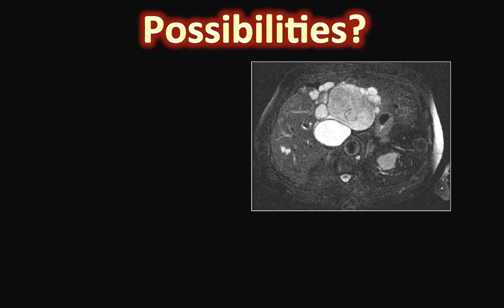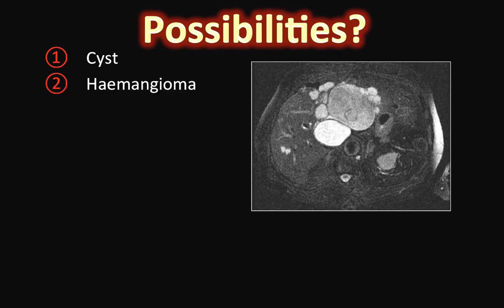So what are the possibilities? Hepatic cysts, whether isolated cysts or in the context of polycystic liver disease, do not have this complicated, septated or loculated appearance. Hemangiomas have a characteristic appearance after IV contrast administration with filling from the periphery inwards.